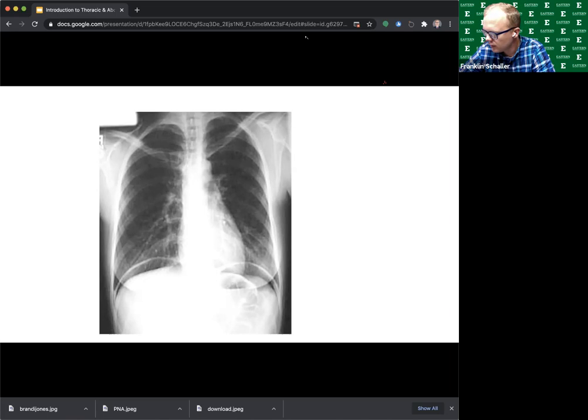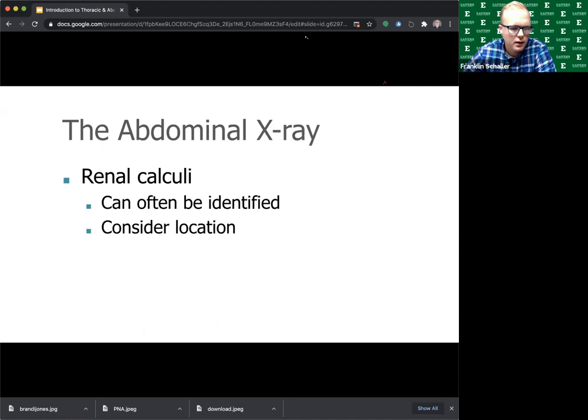Nice. You guys are spot on. So I'm seeing bilaterally, left upper quadrant, 2 arches in the upper abdomen. I would agree. There is bilateral free air here on both left and right hemidiaphragm. I wouldn't be surprised if this patient is going to need surgical intervention immediately. You don't want to miss any type of free air on an abdominal x-ray. So I see it bilaterally here. Do you guys all see that there? Should I try to draw it out? Everyone's nodding their head. Yes. Okay. Yeah. Cool. All right.